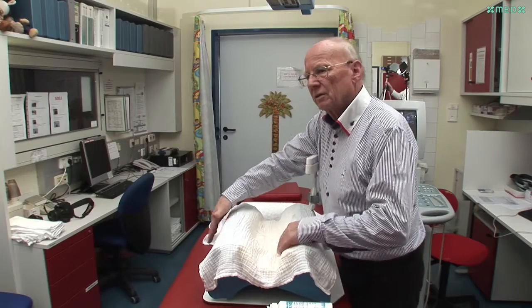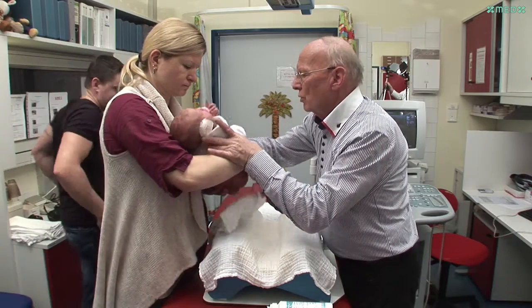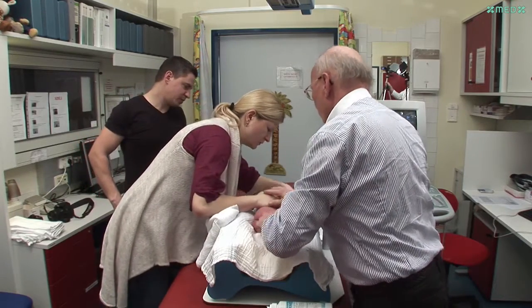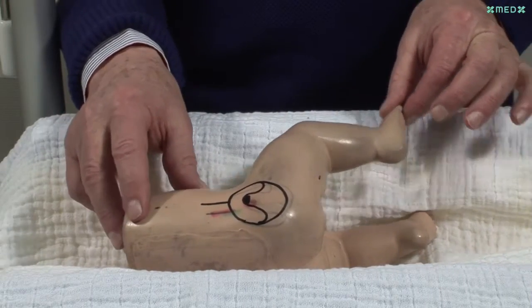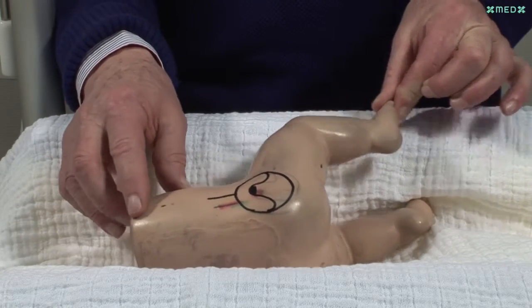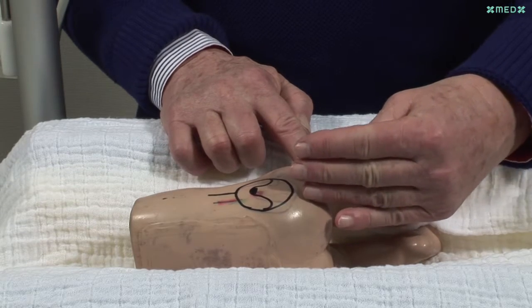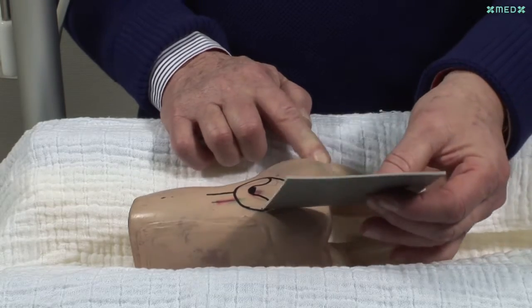The doctor guides the mother. He takes the baby and places the baby into the cradle so that the right hip faces the examiner. The mother's right hand is placed on the baby's right shoulder, and she should not pull on the leg. The baby's leg is gently pushed down into the cradle and should not protrude beyond the cradle sides. This way the hip is gently internally rotated, and the femoral head, neck and trochanter are in the frontal plane, parallel to the bolsters of the cradle.